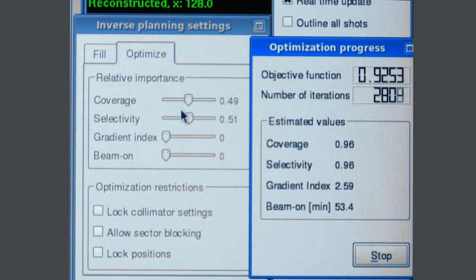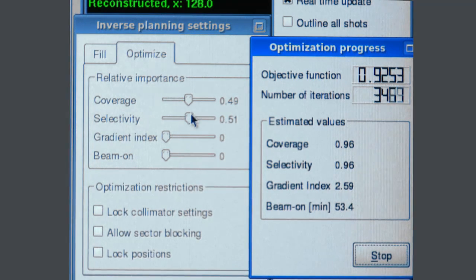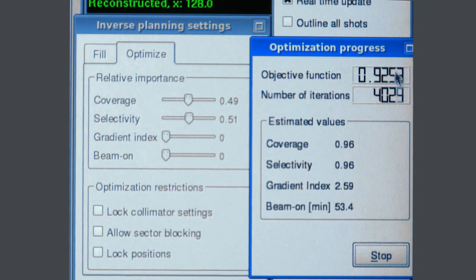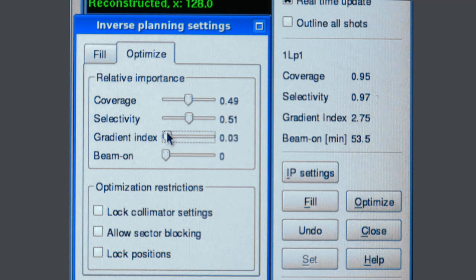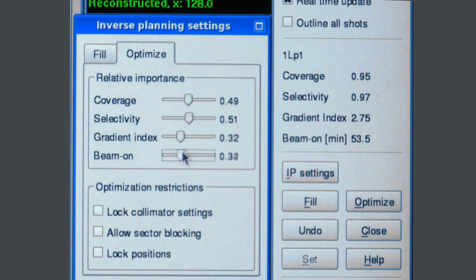A personal favourite is to give equal weight to coverage and selectivity. The scoring function displayed is then equal to the Paddock or new conformity index. However, if for some reason I was more concerned with reducing treatment time or increasing dose gradient, I can simply increase the weight of that particular parameter and then re-optimise.